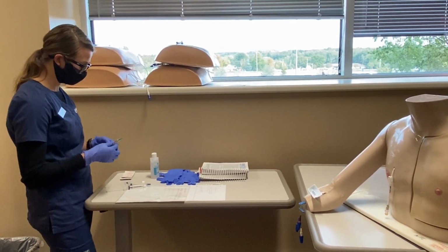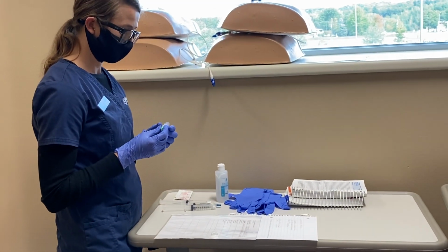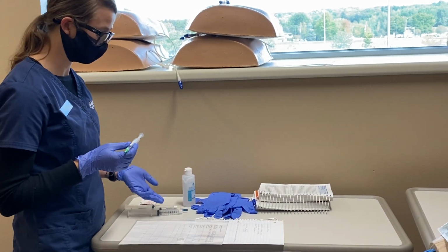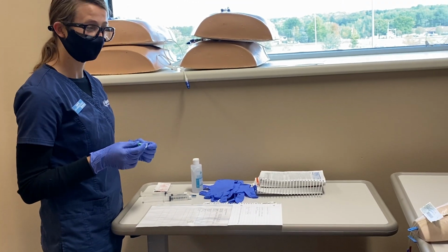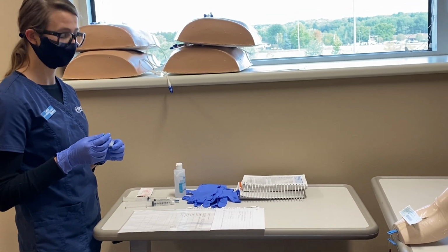So I'm going to go ahead and look here. So we're administering hydromorphone today. It is compatible with normal saline. It does not need to be diluted, and the rate is going to be 1 milliliter per every 2 to 3 minutes.